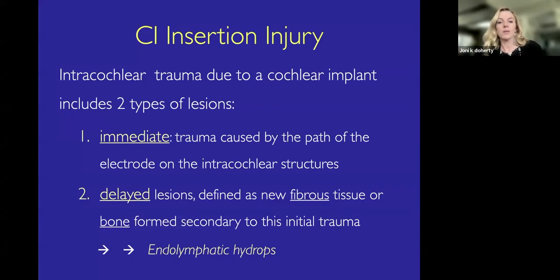Cochlear implant insertion injury has two types. There's trauma that is immediate, caused by the path of the electrode on the intracochlear structures.